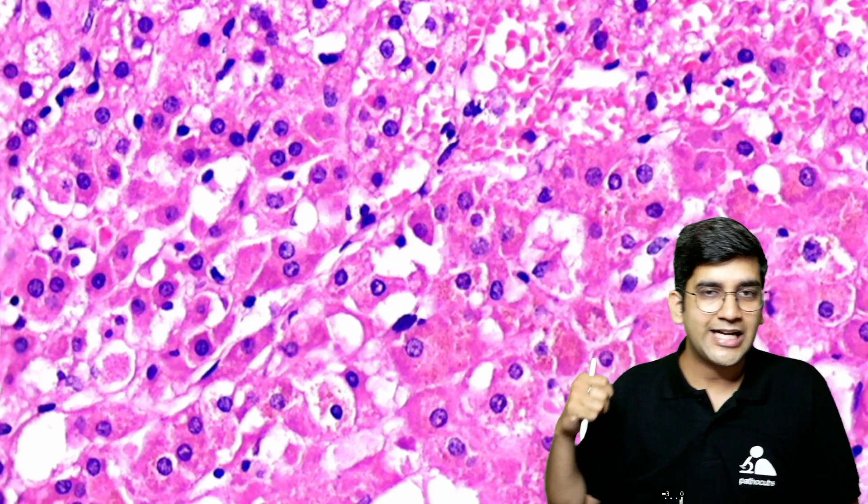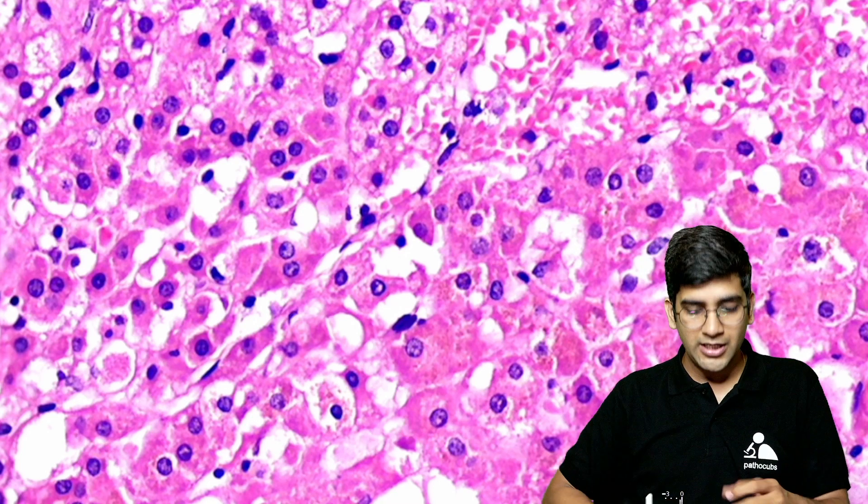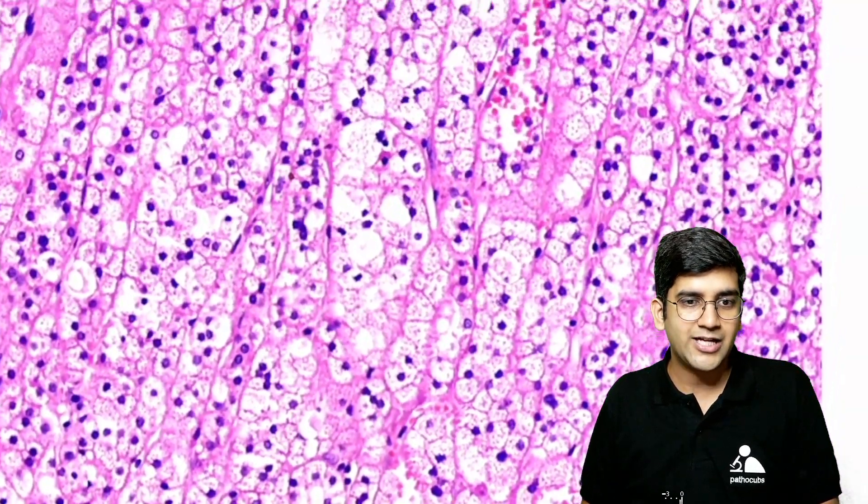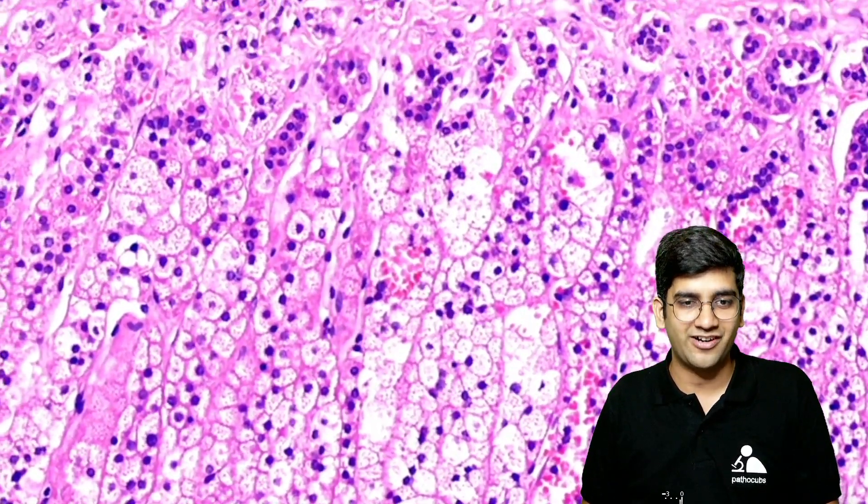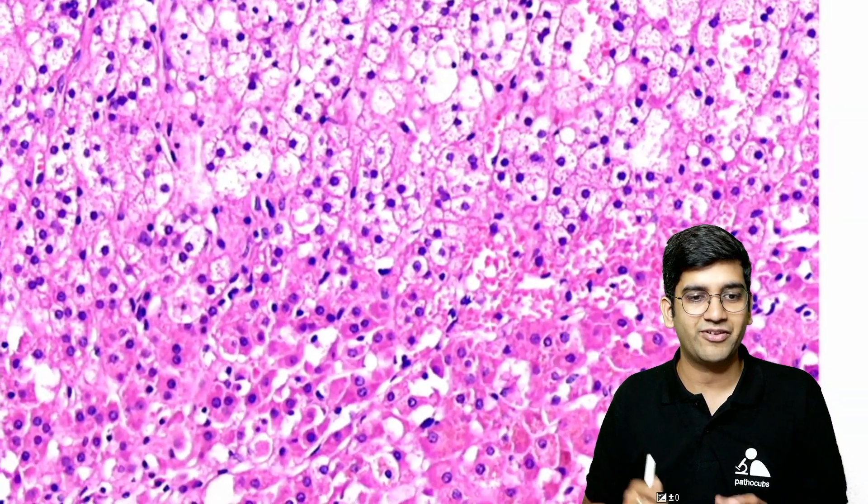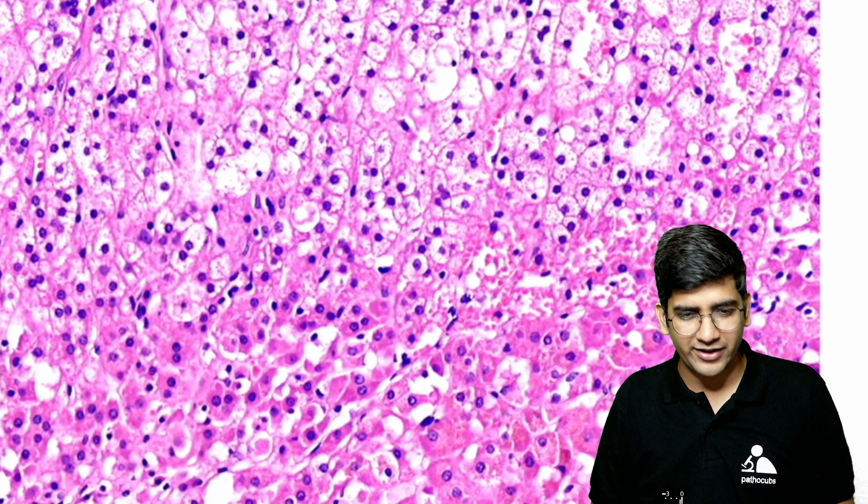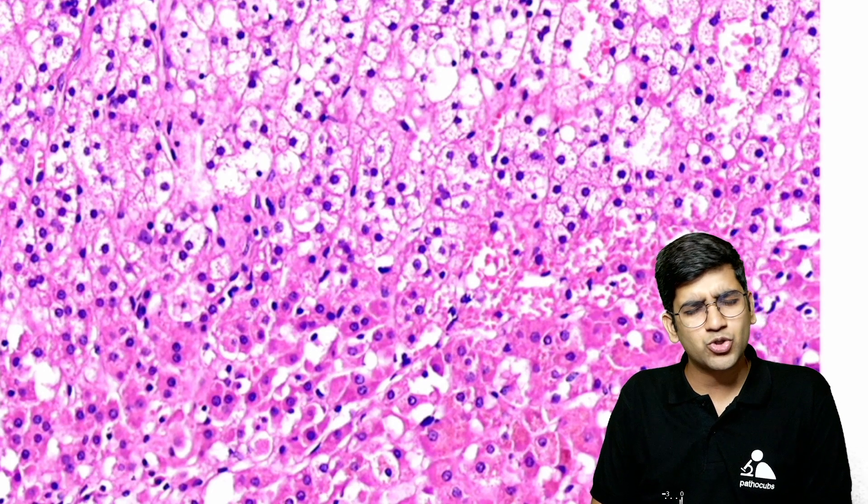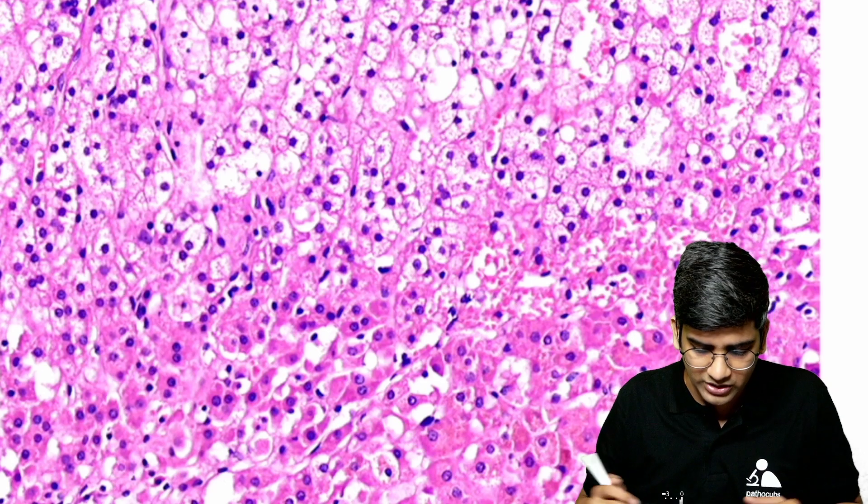That's very very important that's how reticularis looks in a biopsy. So I'm just going up zona glomerulosa zona fasciculata and zona reticularis. That's a beauty of an adrenal gland. You have the glomerulosa you have the fasciculata in the center and you have the reticularis deep down below that. I just want to add one more finding here because I feel that a postgraduate should know this most of you guys will definitely know this if you look at this.